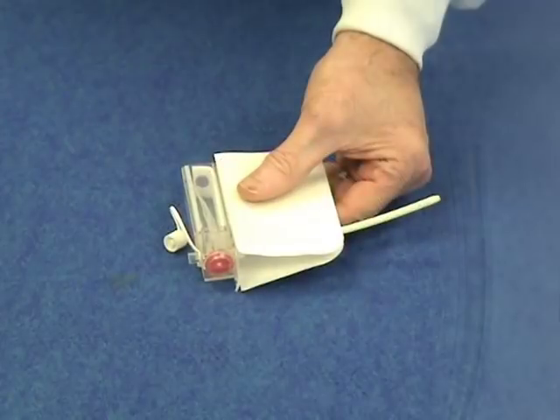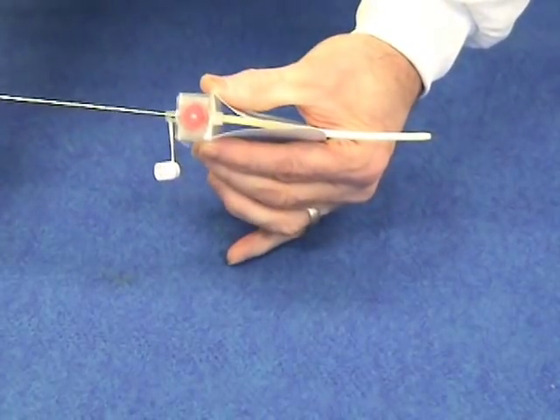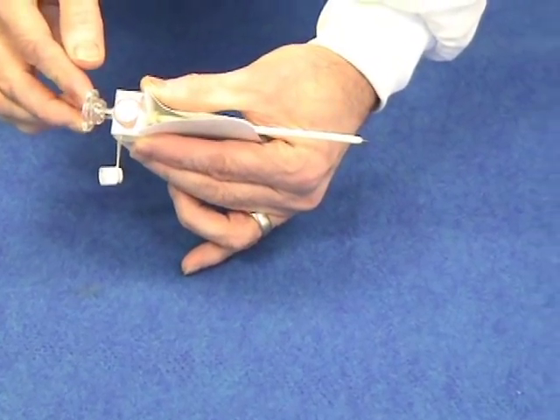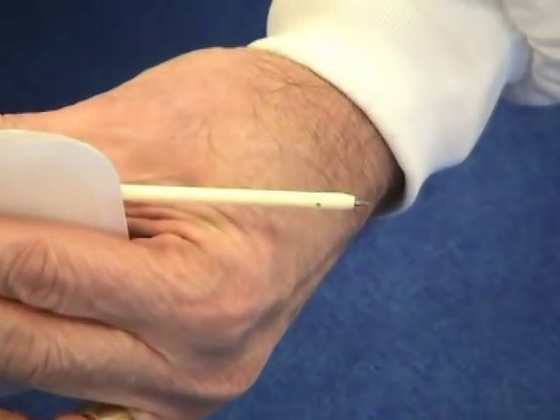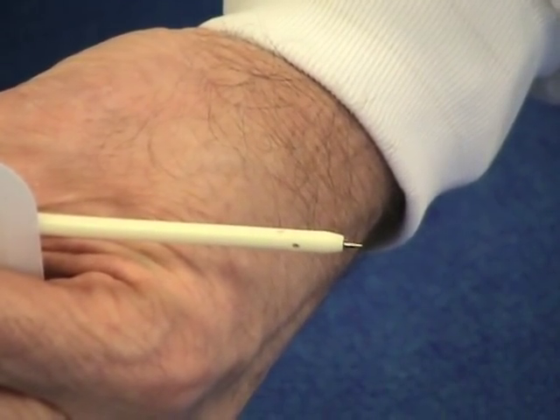Now let's take a closer look at the thoracic vent. After removing the protective cover, the trocar may be introduced into the device through the self-sealing port. The point of the trocar should extend slightly beyond the tip of the catheter.